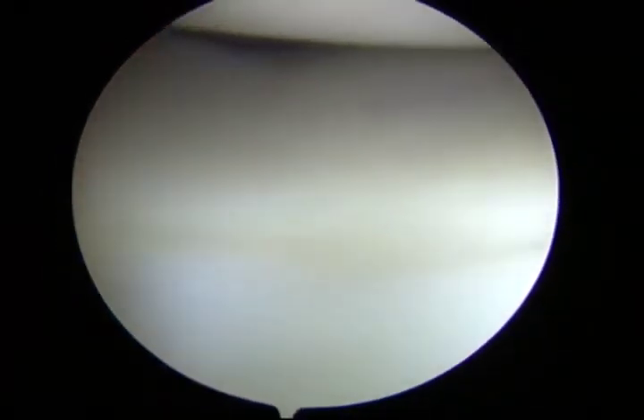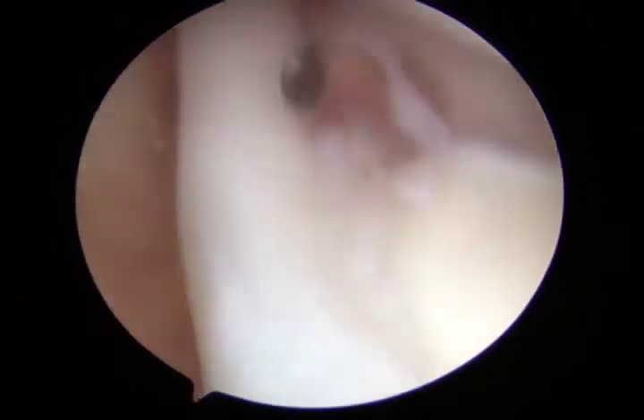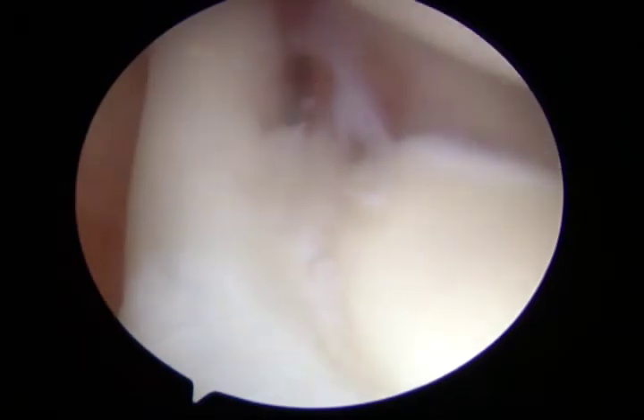Once the diagnostic arthroscopy is complete, revealing no additional pathology, an 18 gauge spinal needle is inserted high in the rotator interval. Its trajectory is checked to ensure that the needle bevel can reach the base of the biceps tendon at the correct angle.